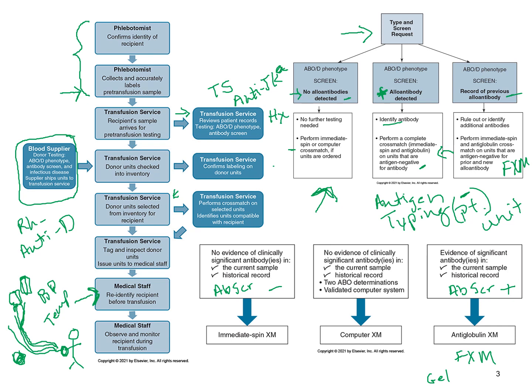Now, computer cross matches, these get a little hard for me to stomach just because when I did cross matching, I did cross matching in tube, so I always liked that immediate spin cross match. I think it just kind of helps give that extra check. But I know a lot of facilities, just to save time and things like that, they do use computer cross matches now.